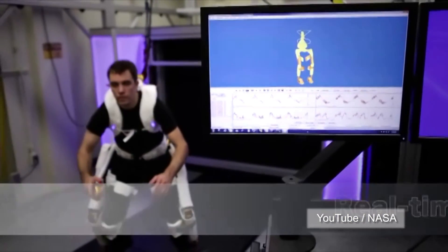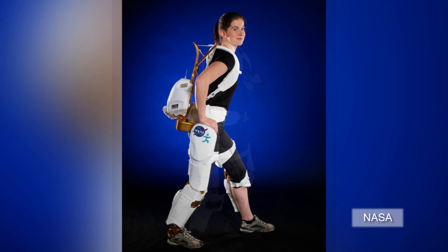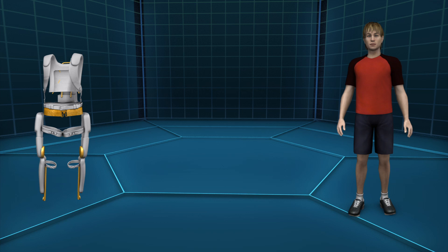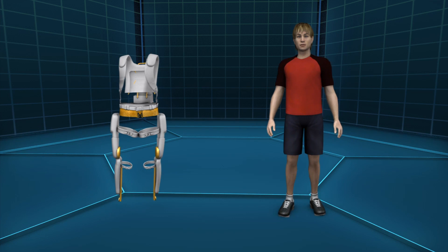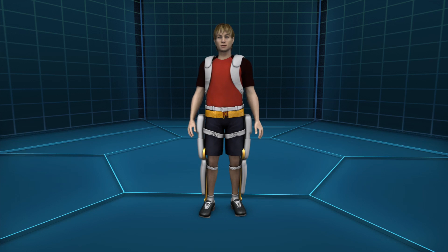Researchers for NASA are working on a robotic exoskeleton for astronauts to assist or inhibit movements in leg joints. The X-1 robotic exoskeleton is worn over the legs with a harness that reaches up the back and around the shoulders.